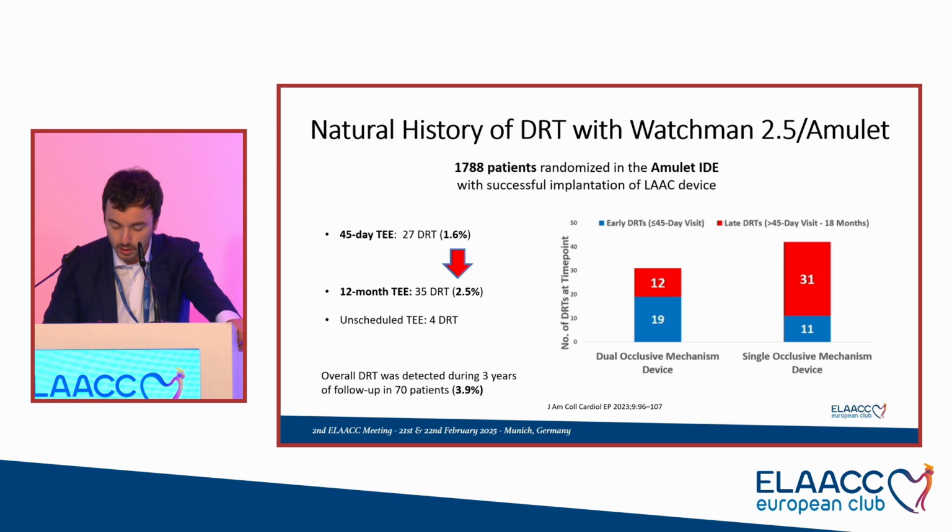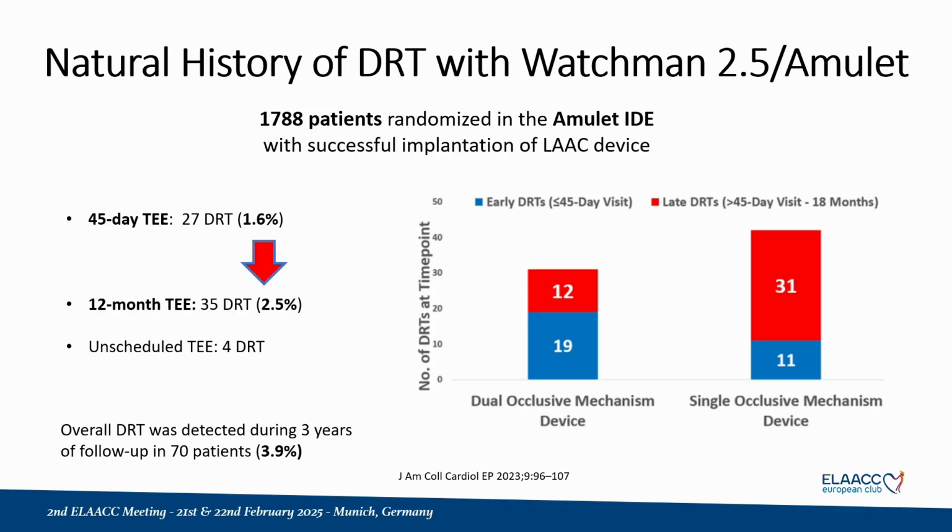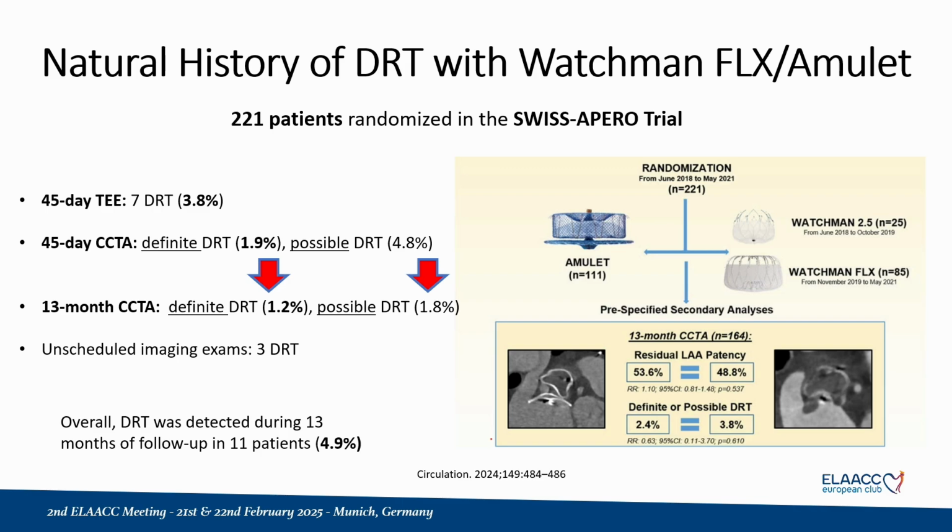In the Amulet IDE, we had a small increase of DRT especially in the Watchman group, most likely due to the use of oral anticoagulation in the first 45 days. Whereas in the Swiss Apero, the antithrombotic therapy after procedure consisted of antiplatelet therapy only in more than 90% of cases.